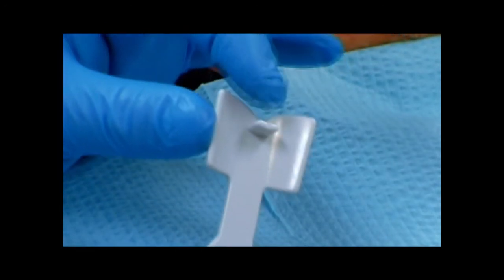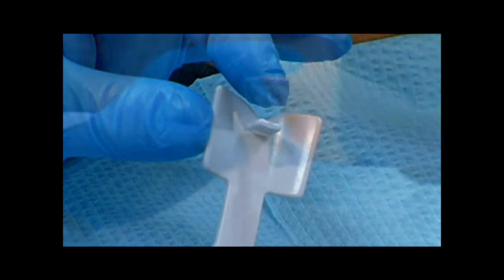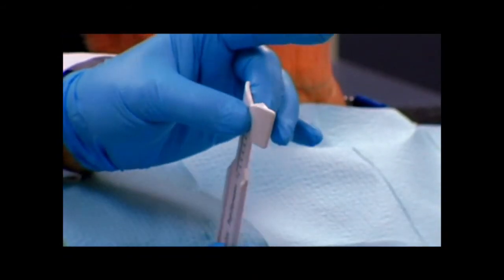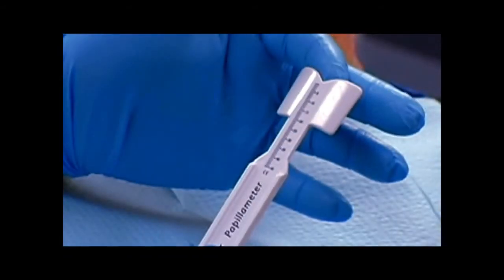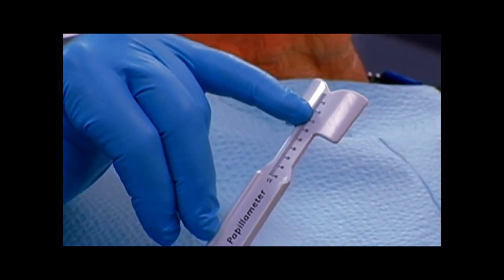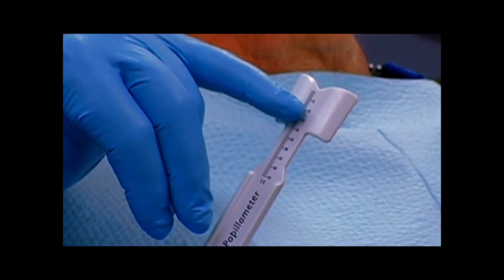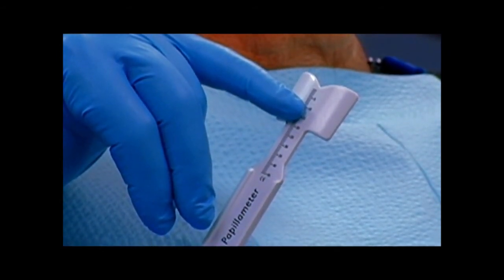And where this meets the gauge here, that would be at the 0 point. In other words, where it rests on the incisive papilla, that'll be our 0 point. And when we press this into the patient's mouth, whatever reading we get here will be interpreted as a number of millimeters between the patient's anterior papilla and the patient's lip as it's recorded.